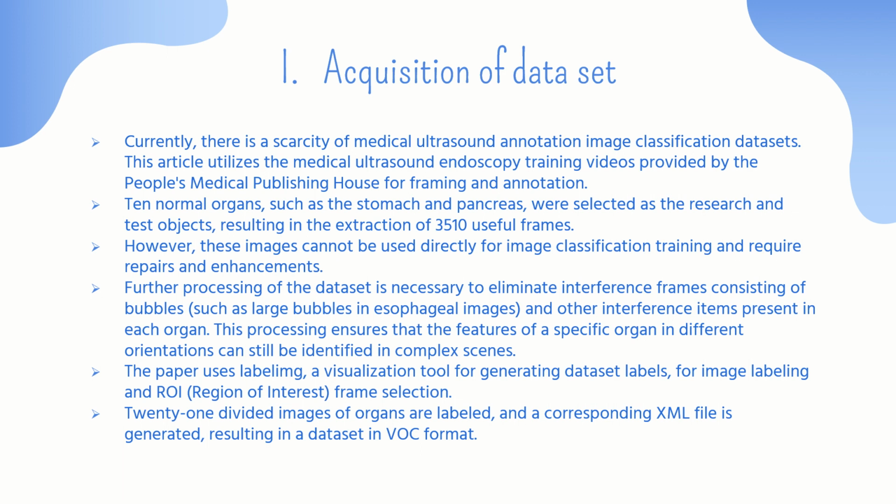Through the framing of the image and video, enough frames are obtained to form an image dataset. When framing, the video framing algorithm is used for frame extraction, and the interval is set to 1 to 5 frames. This study selected 10 normal organs such as stomach and pancreas as the research and test objects, and finally extracted 3510 pictures with useful frames.